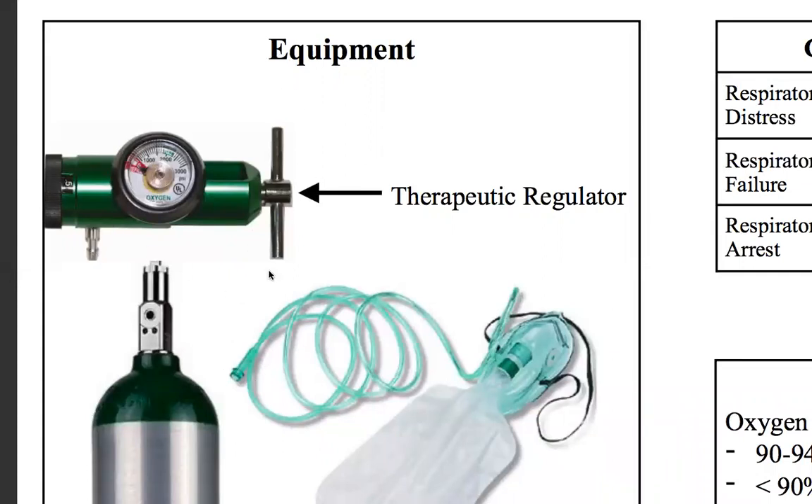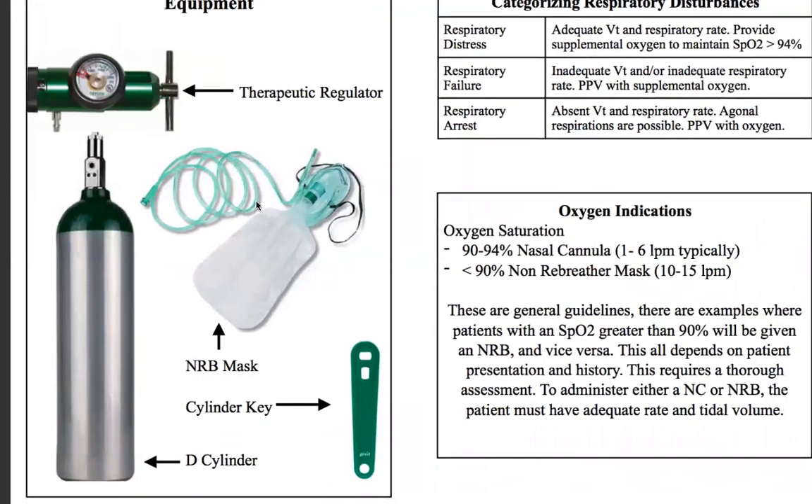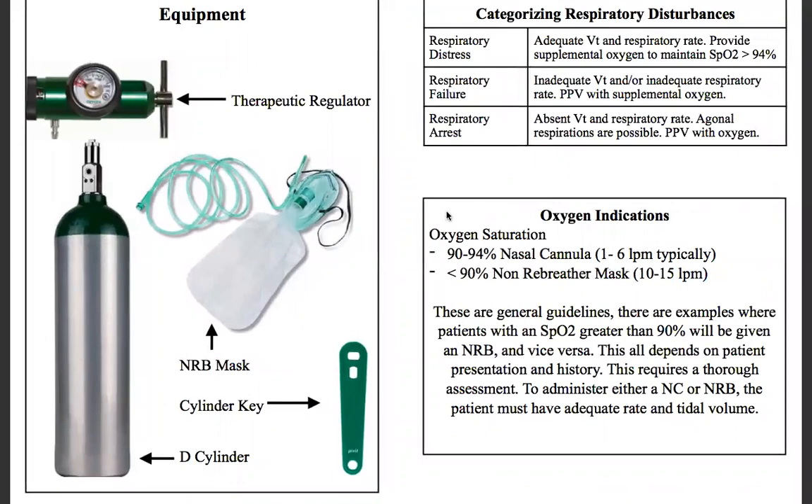This is called the connector tree — this is the port where you connect the tubing of the non-breather mask. This is the T-handle, which tightens down the regulator to the stem of the O2 tank right here. This is a D tank, our portable tank that we carry into the scene with us. This is the cylinder key — this plastic piece opens up the valve up here that allows you to pressurize the regulator. And this is your non-breather mask, which you put on the patient's face.